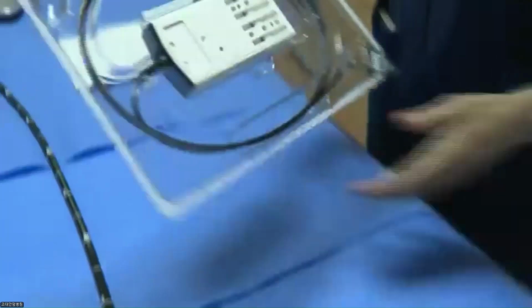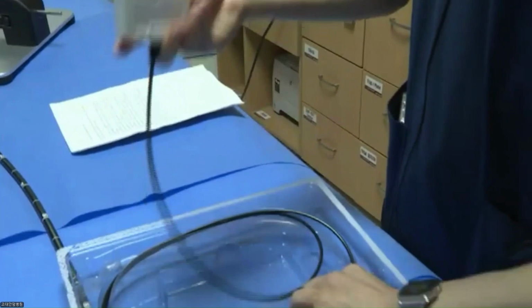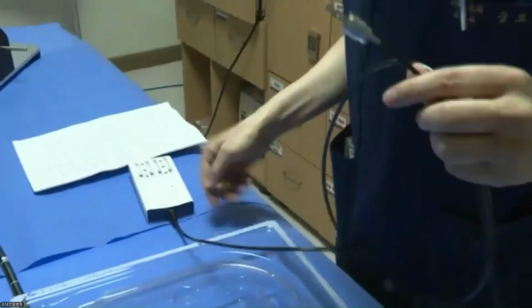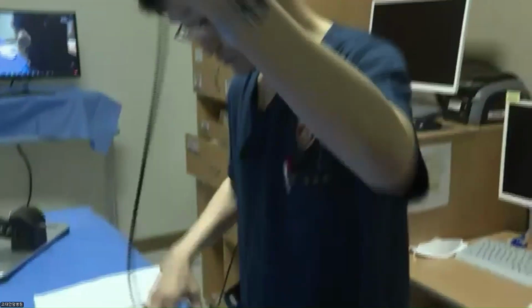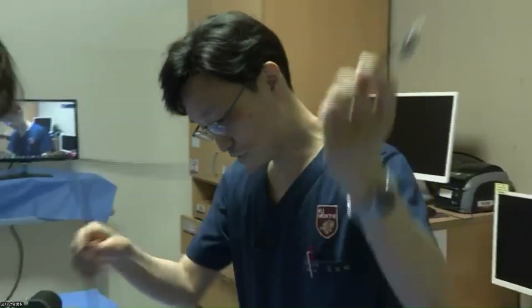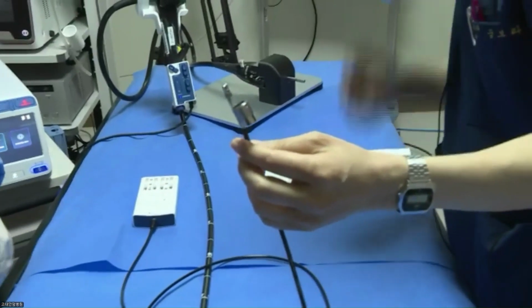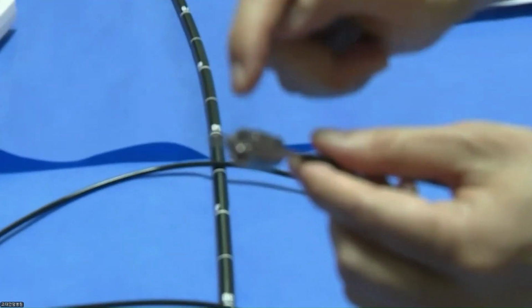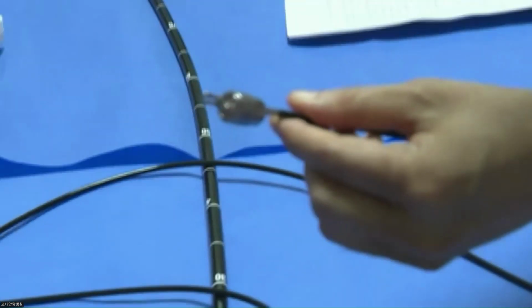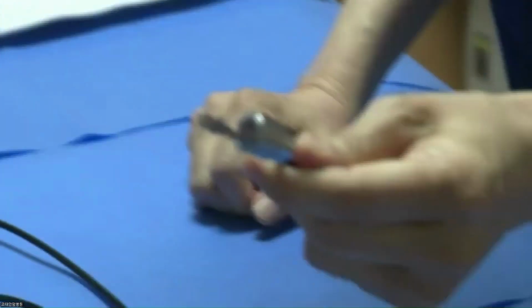And this is the sterile robotic device. And here is the cartridge and the wire. And this is the head of the device, where you can see the arm, the wrist joints, and then the hand, which can grip and release. Please focus more precisely. Yes, focus more, please.